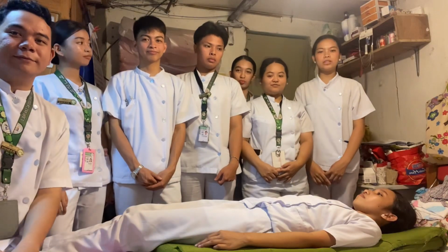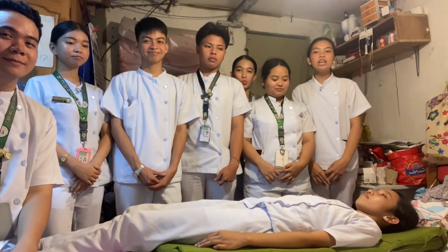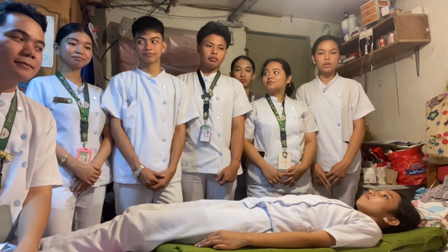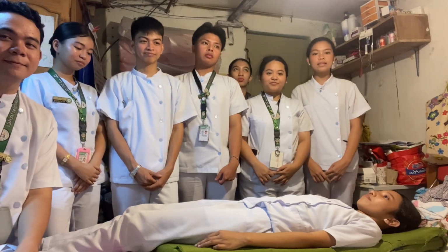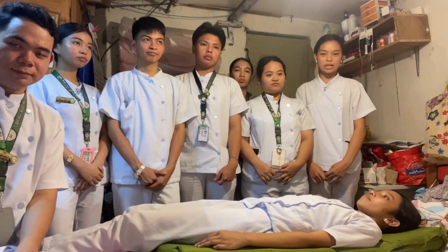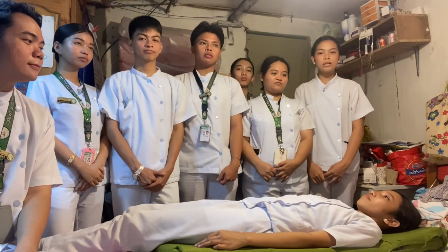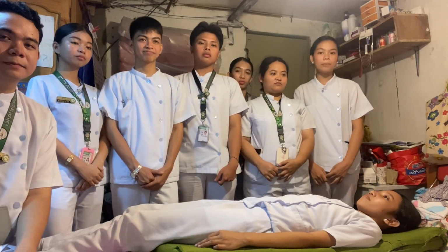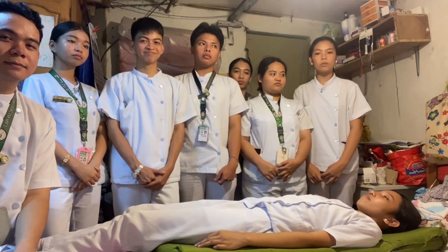Throughout the procedure, it is very important to ensure that all the appropriate body mechanics are done, to ensure that the patient and the nurse are safe and that there are no further injuries to the patient. It is also very important to use appropriate assistive devices for handling mobility as required by the patient. And it is also very important to communicate well to the patient to ensure that the patient understood all the procedures that will be done, and it is also a way to ask for the patient's cooperation and to ensure that the patient also gains independence throughout the procedure.